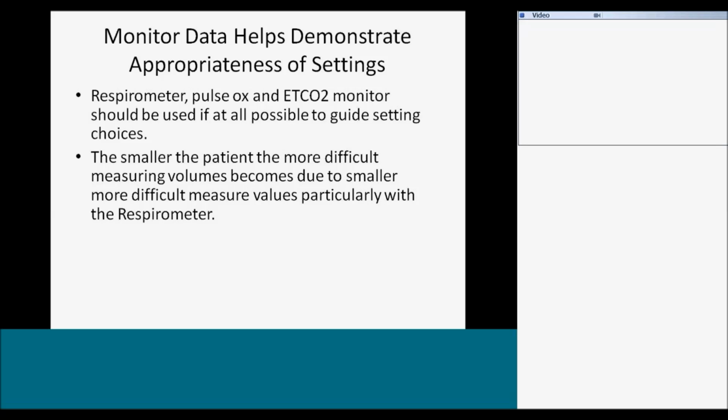For pediatrics, particularly infants, the respirometer is not going to be useful, and sometimes even the waveform that you get on end-tidal CO2 is not going to be that useful. So you're going to be doing it based on some standard settings, and then determine that they've got good signs and symptoms of being supported appropriately.